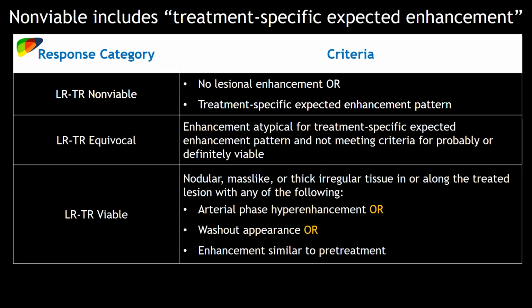And I think it's very helpful when you bring up points like this, because it shows us where LI-RADS works and sometimes where LI-RADS maybe could be improved a little bit. So anyway, that's my feedback on that. Richard and Victoria or Khaled, do you have anything else that you'd like to share or add? No, I just... great observation. Absolutely agree. That's a great observation. And yes, absolutely right. You have to use judgment and not apply LI-RADS blindly. And when things don't work out the way your intuition tells you, that the imaging is telling you what's going on, then communicate with the referrer directly, or be more explicit in the report. Don't just put on the category and stop there.